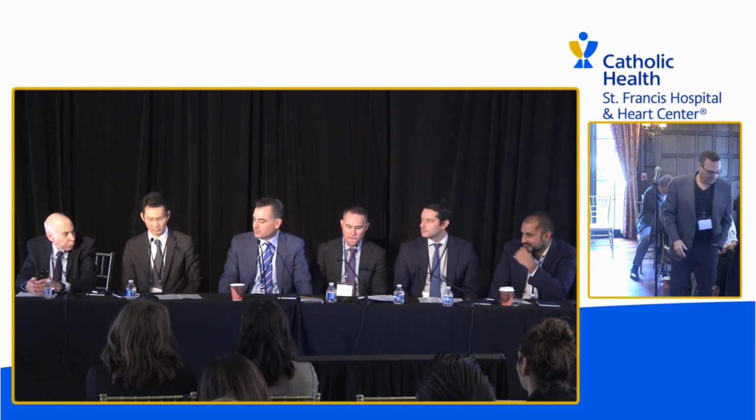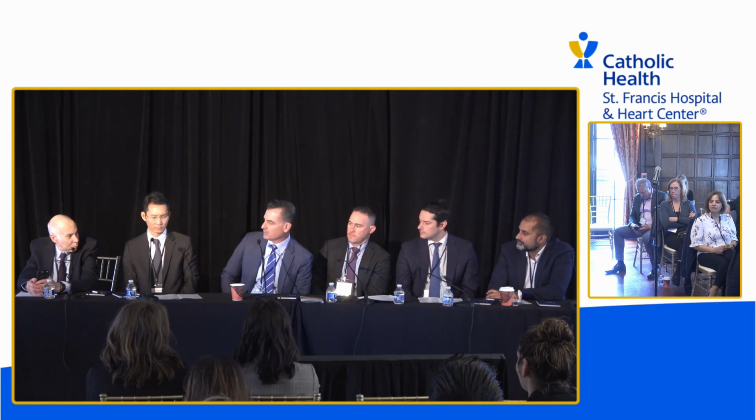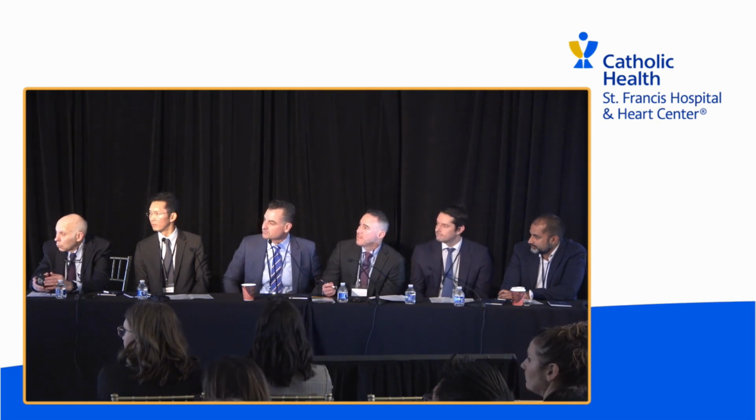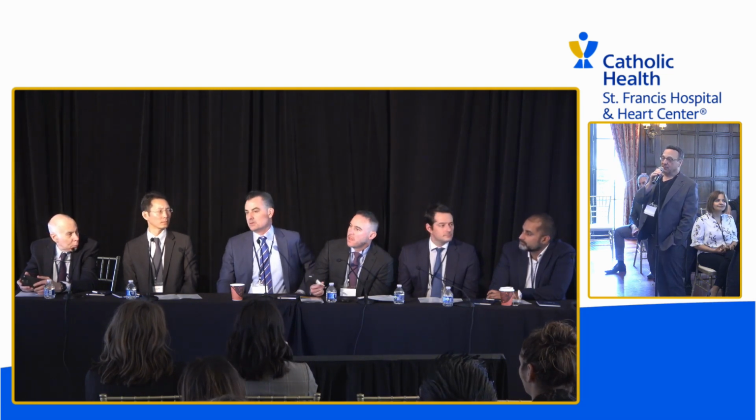Well, a 91-year-old with truly severe AS with a very high gradient, who's going for an open operation, most likely he would just get an aortic valve replacement, and then we would presume that there'd be a significant downgrade of his MR after relieving the LVOT obstruction. Obviously, if he has structural valve deterioration, primary MR, that's a different story, but presumably this was all functional, secondary to the high transvalvular gradient. So even in the OR, my bias would be not to touch the mitral valve in this guy. Yeah. Would you have done it any differently with 71? Again, if it's just functional, you leave it alone, is the mantra.